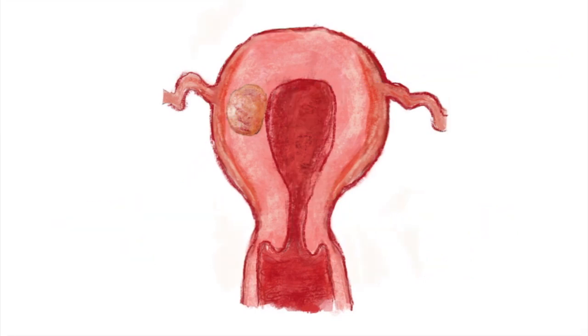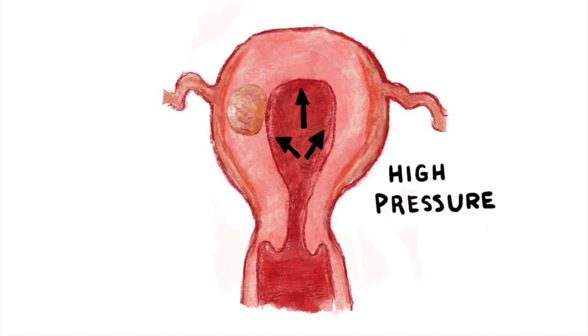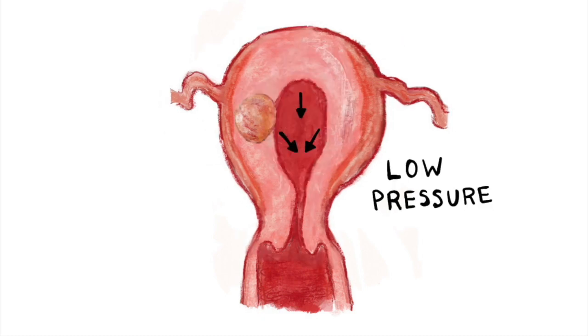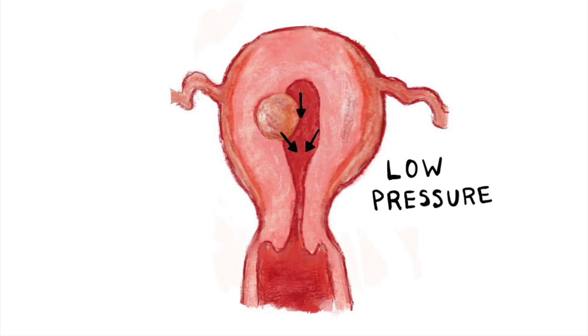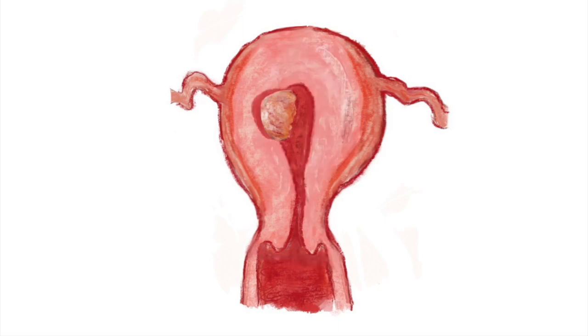The secret is utilizing the intrauterine fluid pressure dynamically to make the tissue do what we need it to do. We use high pressures for better visualization and very low pressures to make the fibroids come to us, because we really don't want to go digging in there blindly. As we decrease the pressure and deflate the cavity, the fibroids that are close to the endometrium get enucleated into the cavity and become visible and approachable for safe resection. We continue to decrease the pressure so the fibroids continue to rise until they are resected completely. Sounds interesting? Let me show you how we do it.